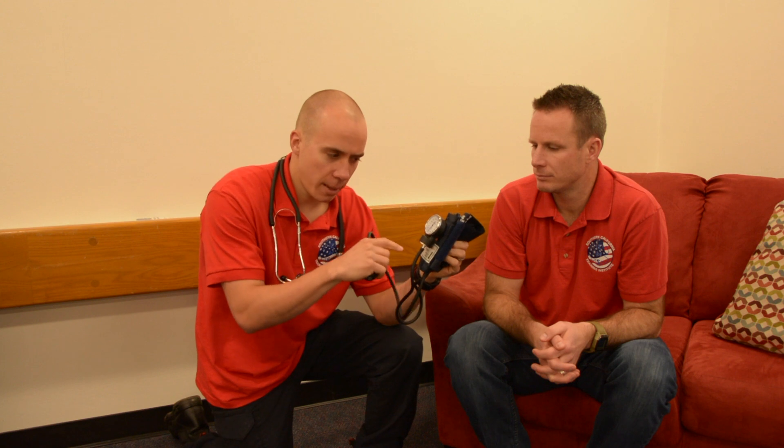If you're taking a blood pressure and it seems totally off, it might be because you haven't checked your blood pressure cuff and the needle may not be in that rectangle. Make sure you fix that — there are sometimes keys you can use to adjust it. Also make sure air stays in your blood pressure cuff: just pump it up, hold it for a while, and it should hold pressure, then release all the way back to zero.